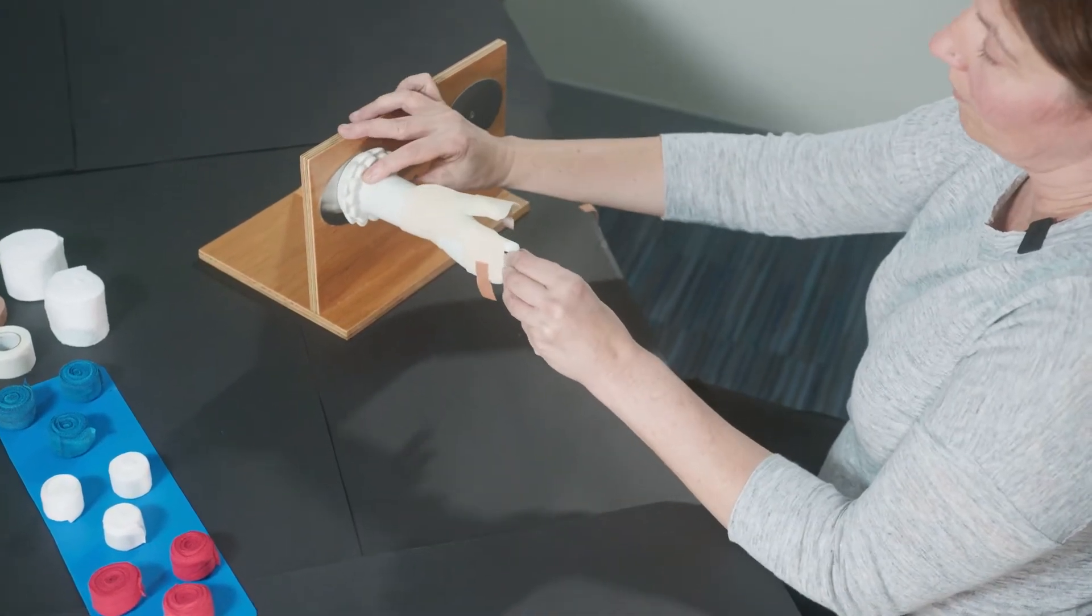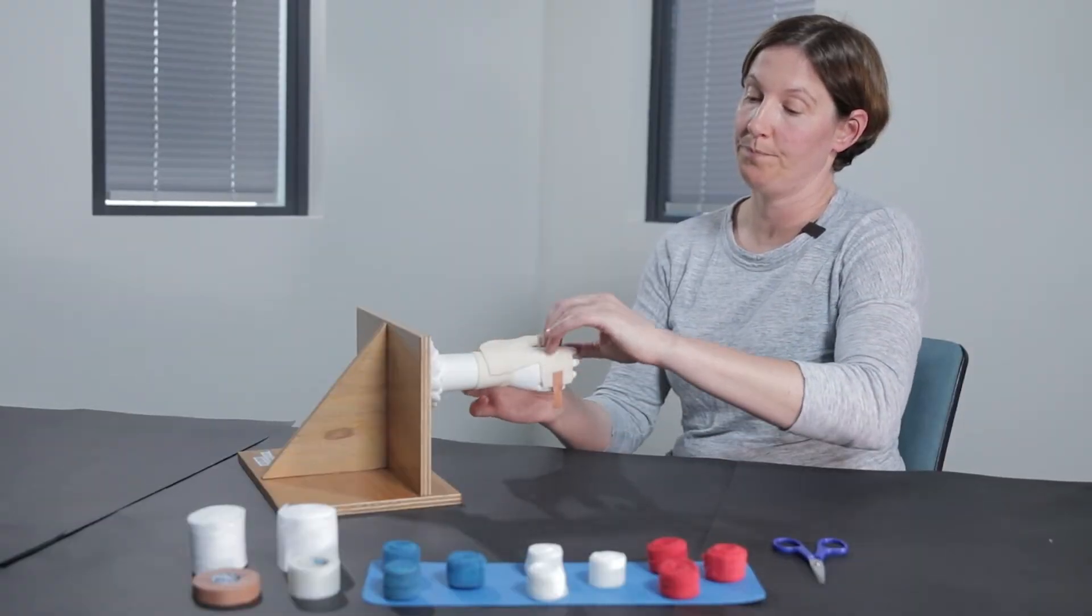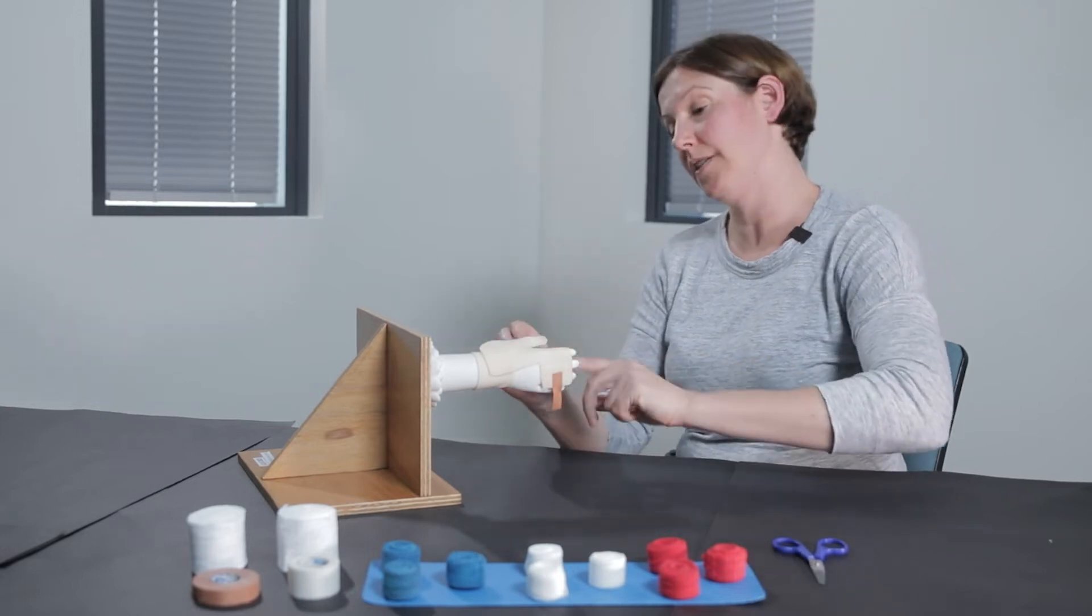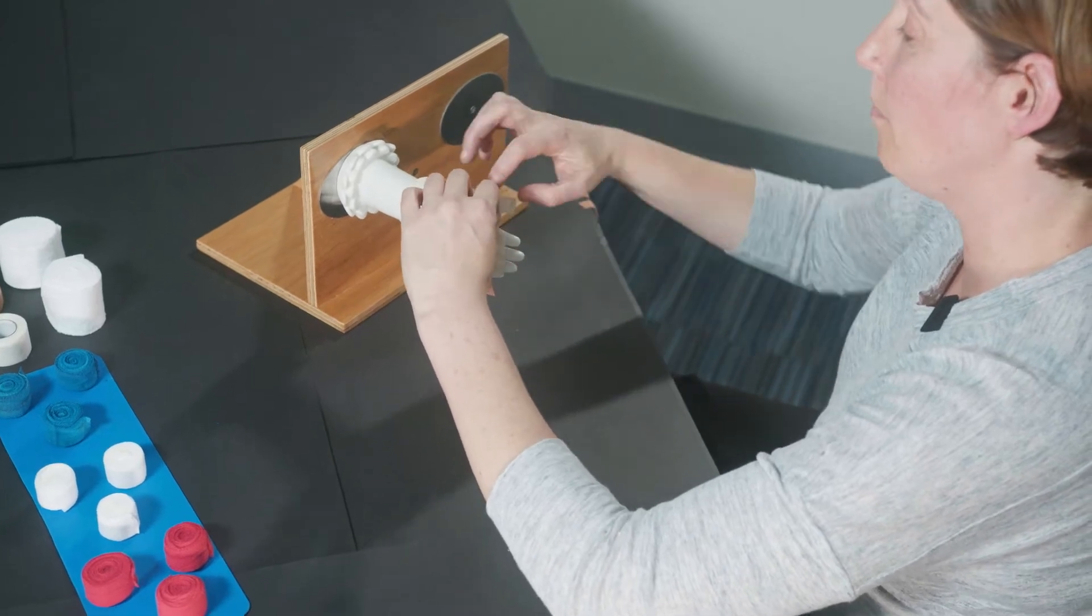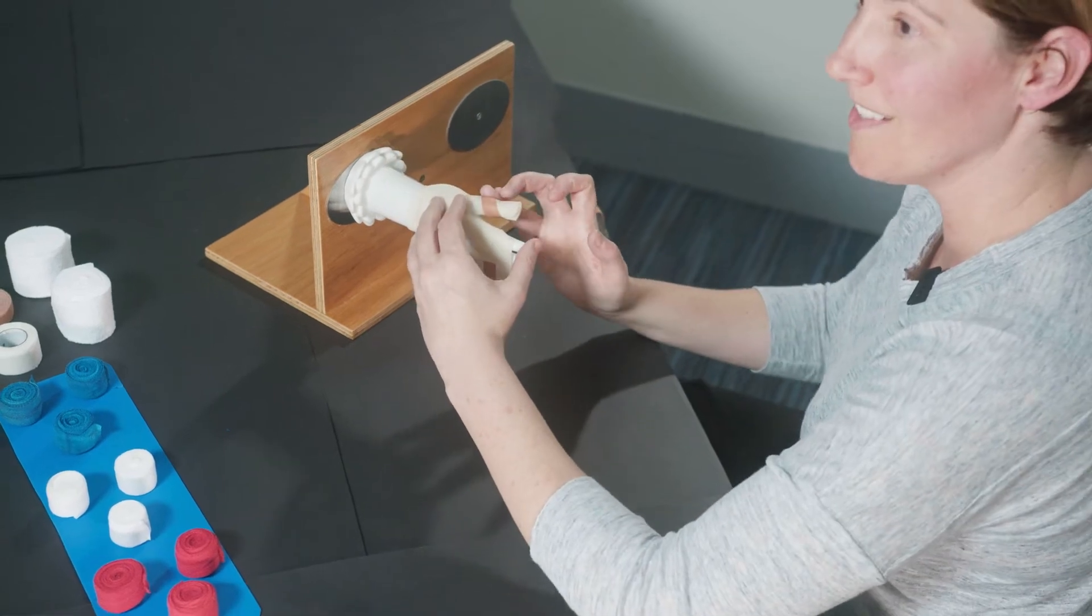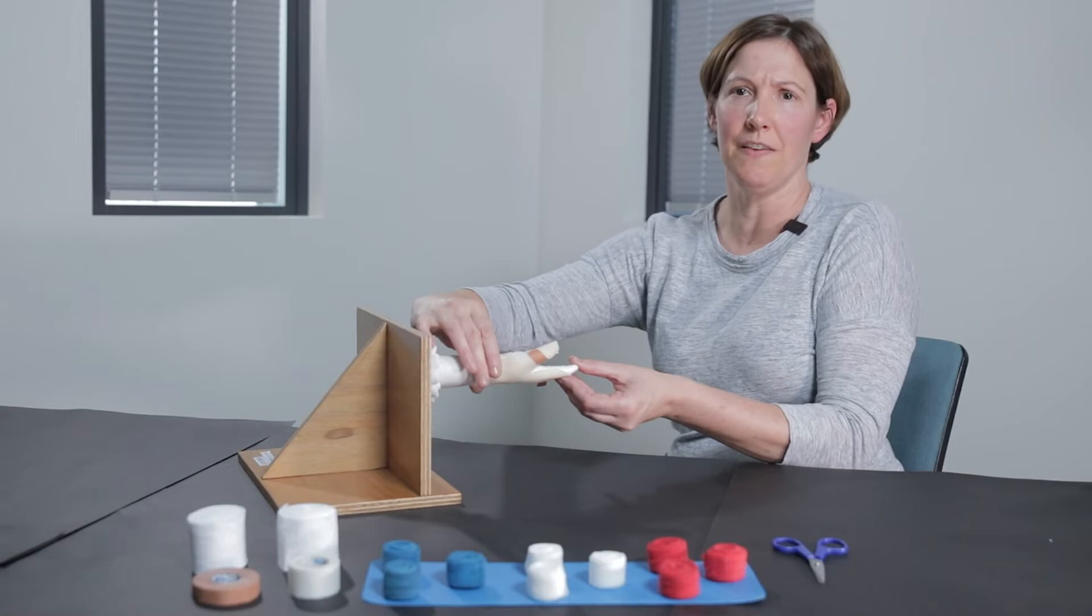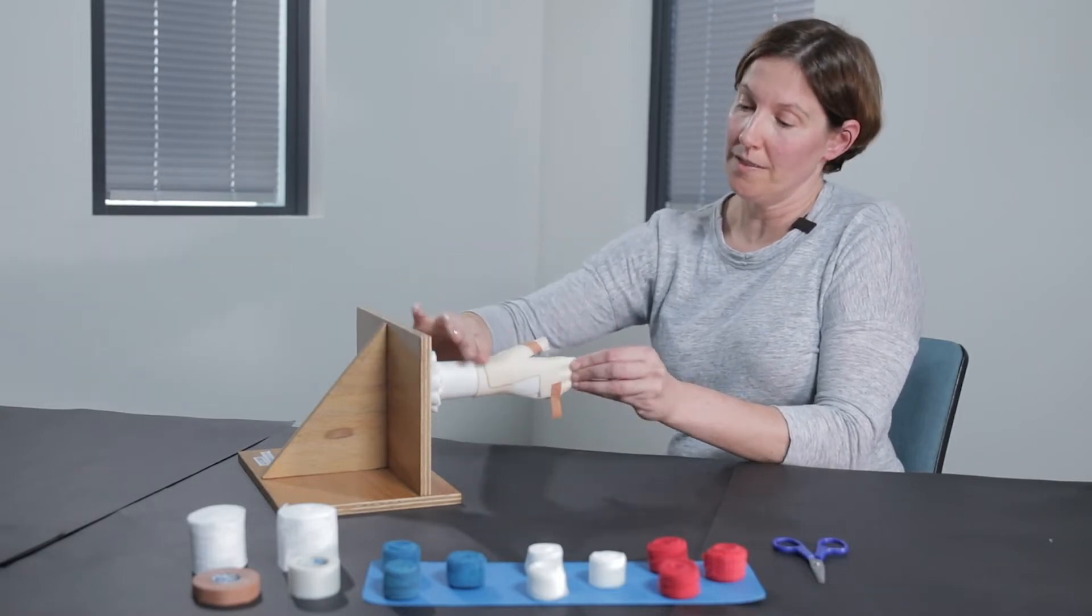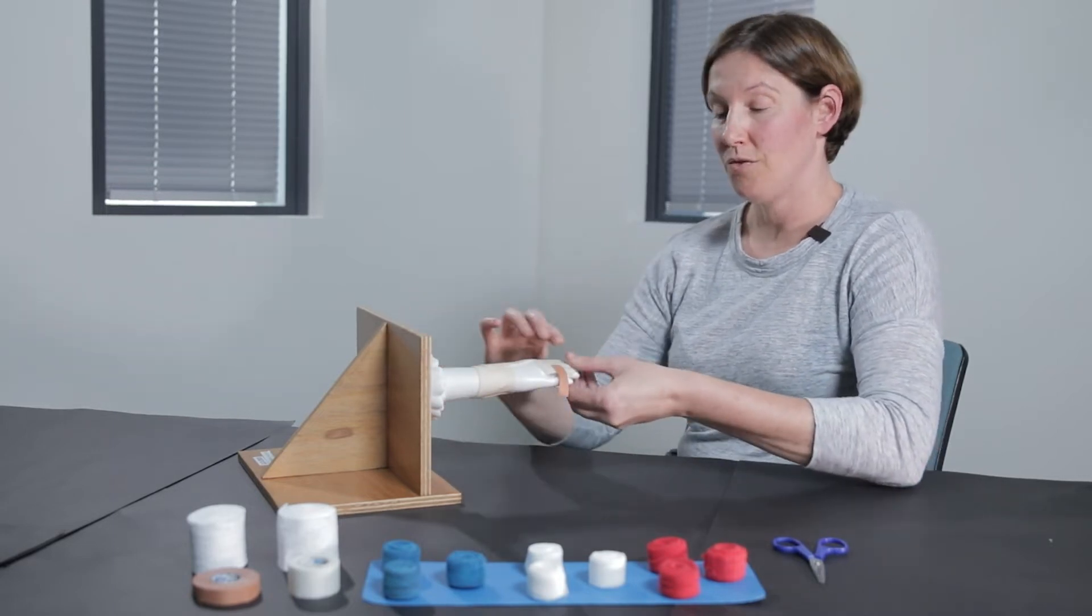I'm going to wrap that dressing around the thumb, making sure that I'm bringing that dressing all the way around and making sure that the tape isn't touching the skin. Now you can already see that this is a little bit fiddly, and it is going to be fiddly at home too. Take your time, and if your template doesn't seem quite right, just stop, adjust your template, and try again.